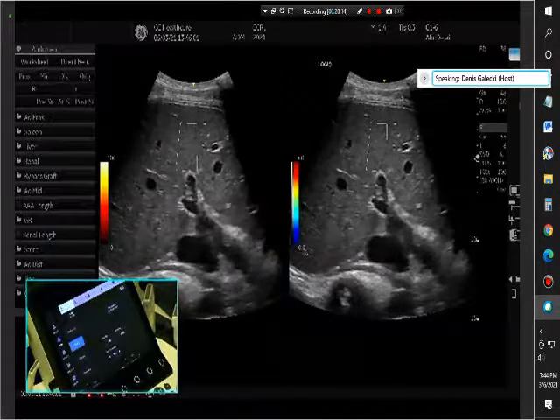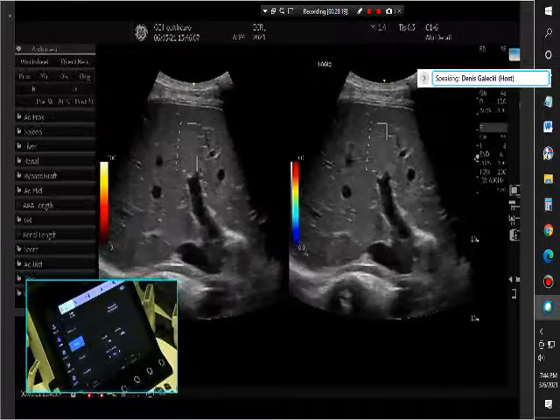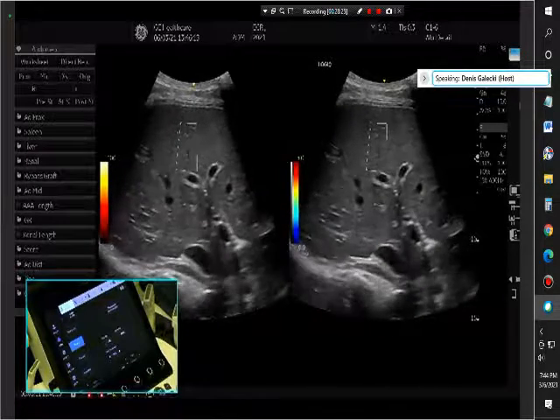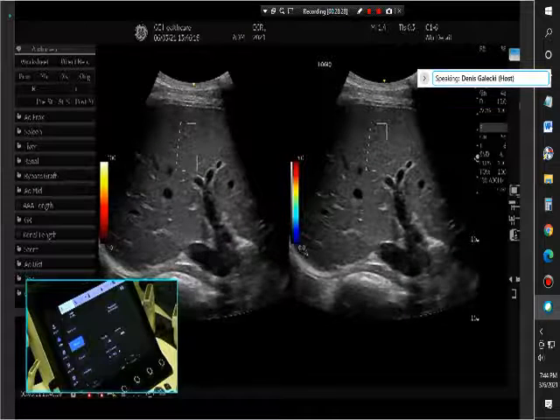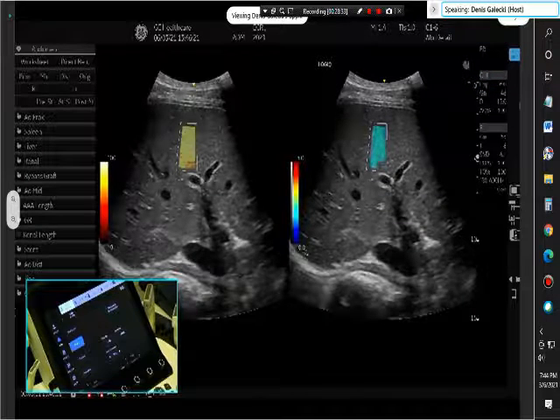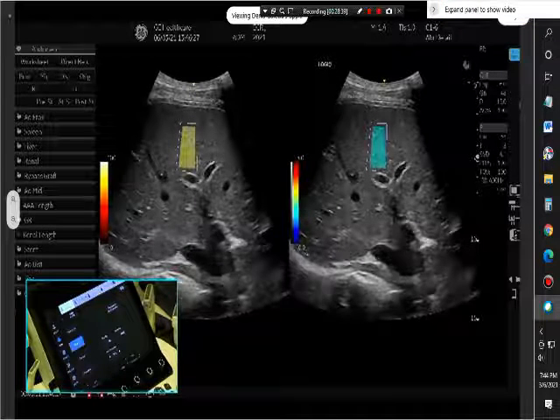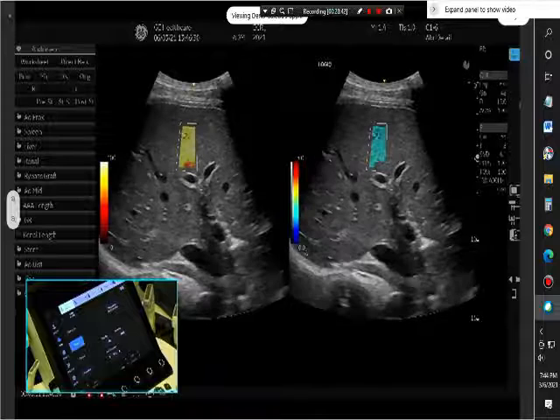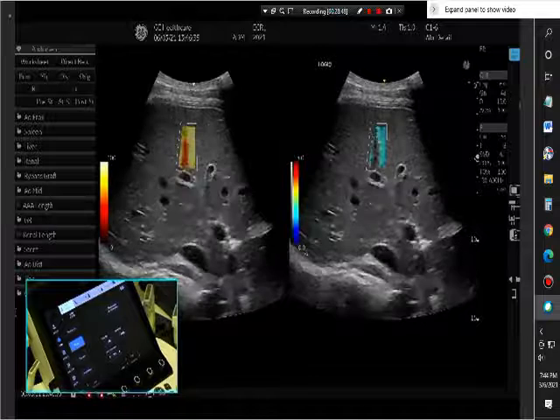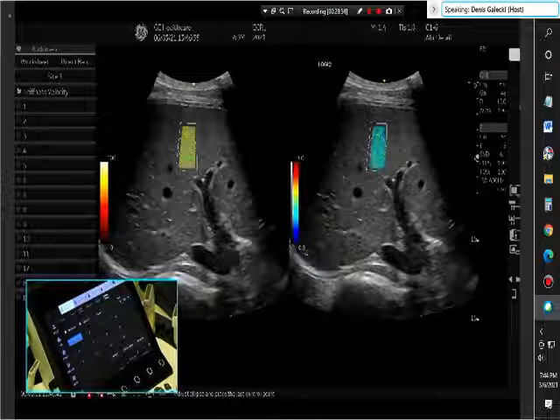You can select between different acquisition types. In this case, I would like to show you the multiple measurement option. Please stop breathing. You see, the system now is acquiring several measurements. Now I go on freeze, and the system immediately offers you the measurements.